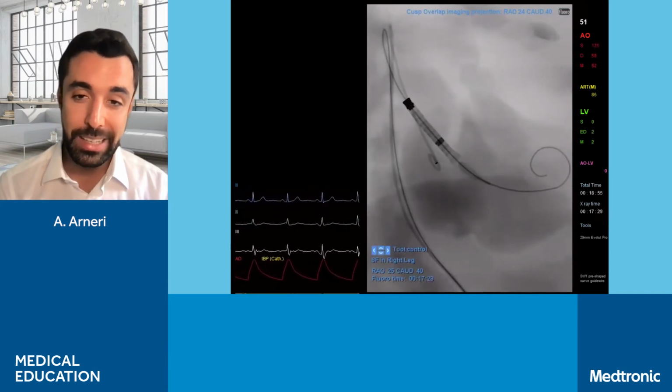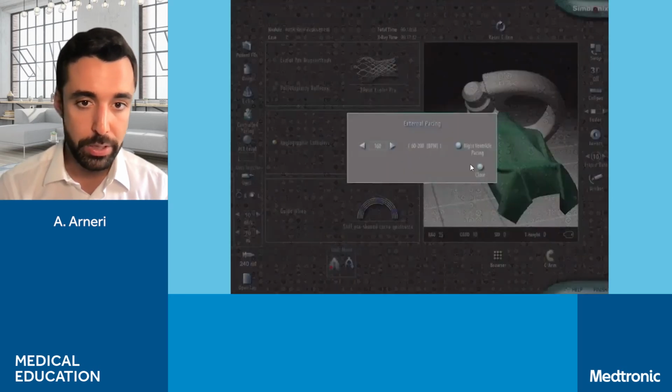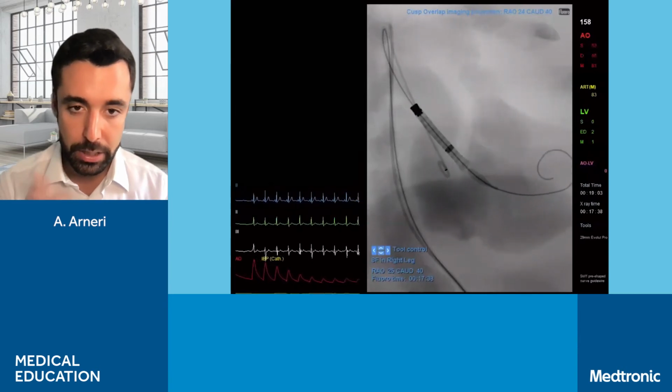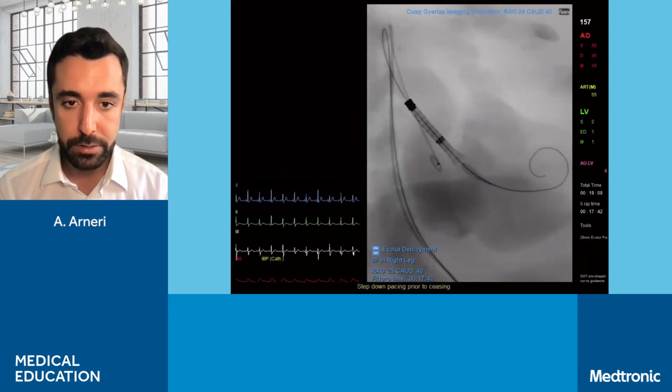So now we can start again with the pacing, because we are at the third node. So we're doing now the pacing, and we can start over in releasing our valve till 80% implant depth.